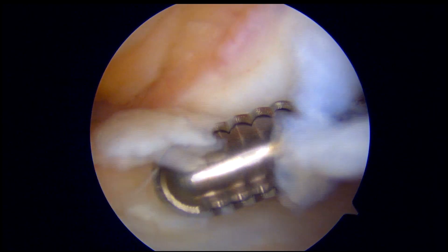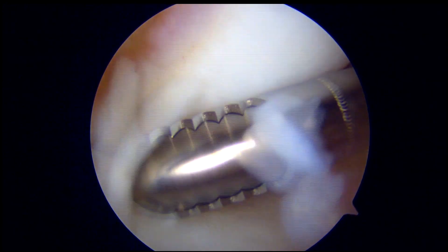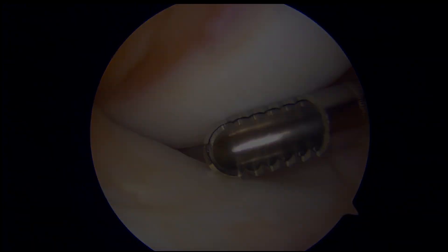You are looking at the medial compartment of the knee — the medial femoral condyle, medial tibial plateau, as well as the medial meniscus.